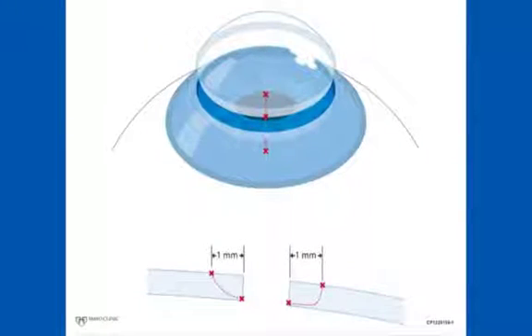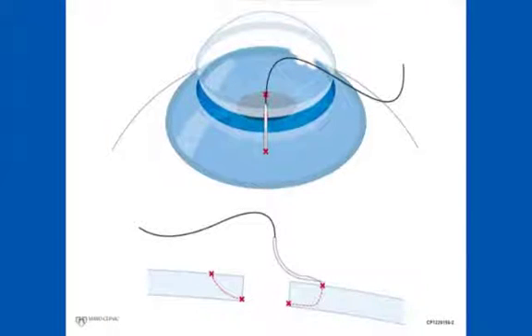First, the surgeon has to look at the cornea and identify the plane that is radial to the graft edge, and then identify the exact positions where the surgeon plans the needle to enter and exit the corneal graft. The first step is placing the needle parallel to the host cornea. This position is the neutral needle holder position for most of the needling we will do on host and graft.